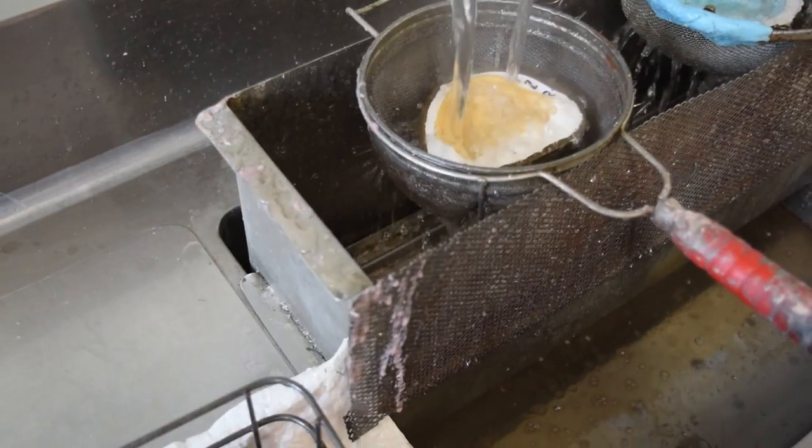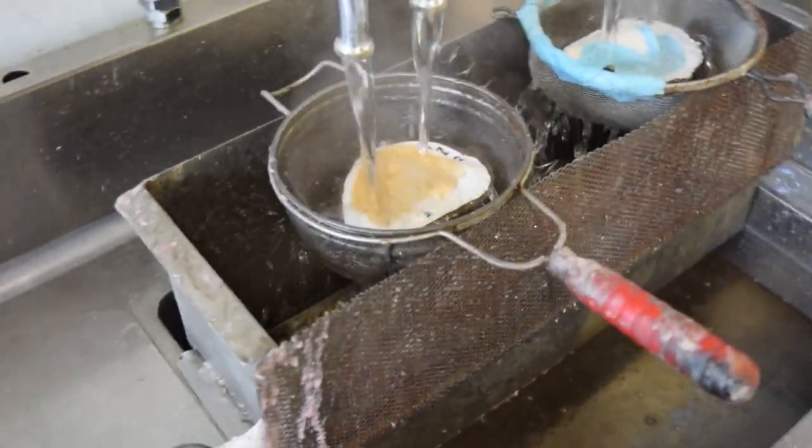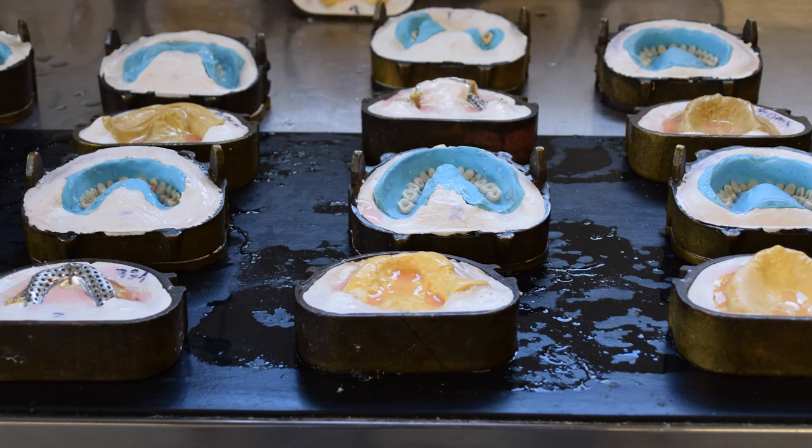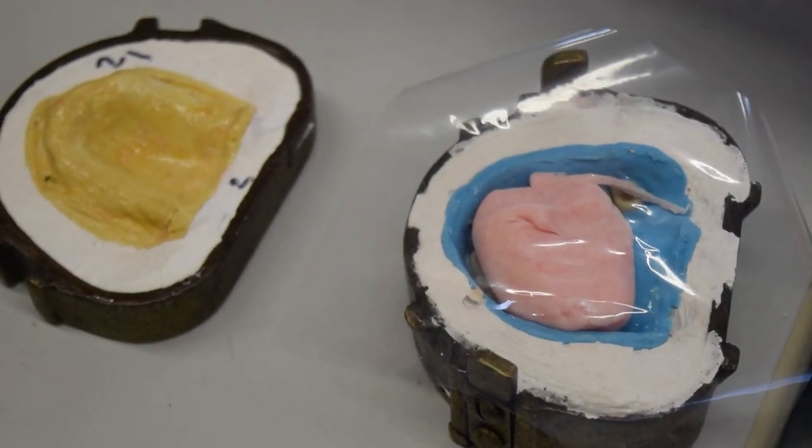Lusitone 199 acrylic powder is prepared and the denture mold is filled. Pressure is applied to the mold to ensure it is completely filled before the denture is placed in a hot water bath to cure.